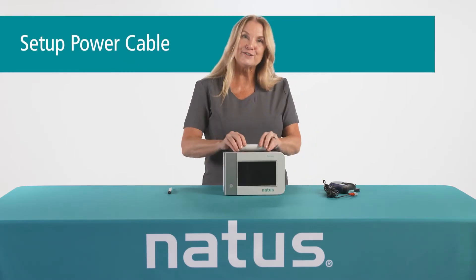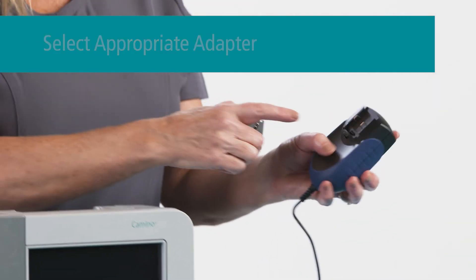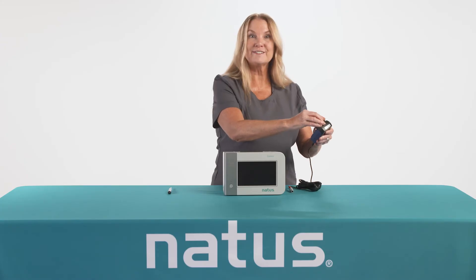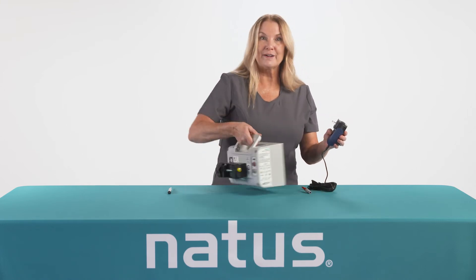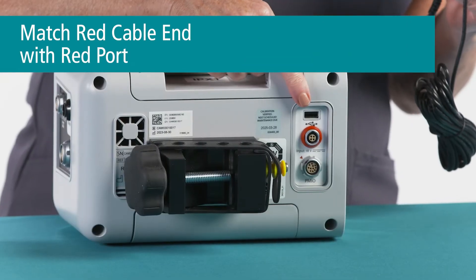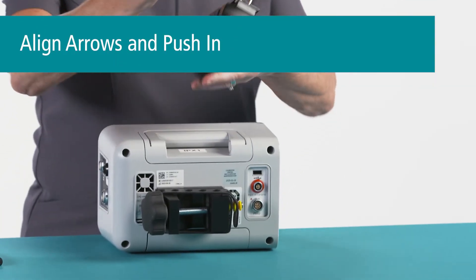The next step is to prepare the power cable by attaching the appropriate country adapter. To do this, press in on the button and slide the adapter in and release. Next, attach the cable to the back of the monitor. Note that the cable is marked with red and it inserts into the red port. Align the arrow on the cable with the arrow on the monitor and push.